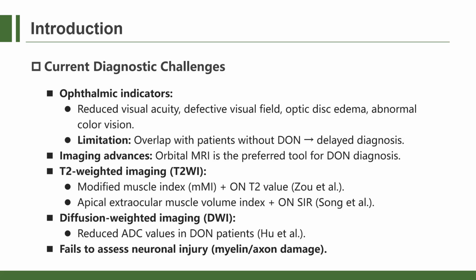Conventional T2-based imaging and DWI are widely used to explore the imaging markers of DON. However, none of the aforementioned techniques directly reflected ON neuronal injury, which are possible pathological changes associated with ON compression.